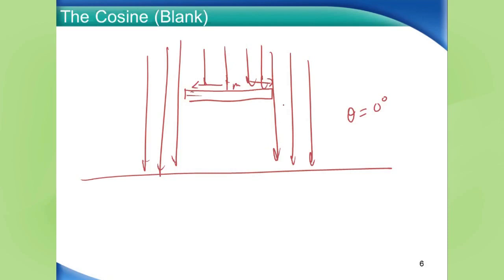So in other words, we're able to tell the length of the stick by measuring it indirectly, by measuring its projection or its shadow. Well, what if we rotate it and don't have it parallel to the ground? What if it's at a different angle that's non-zero? So let's do that. Let's rotate it and say that's an angle of, say, maybe about 30 degrees.